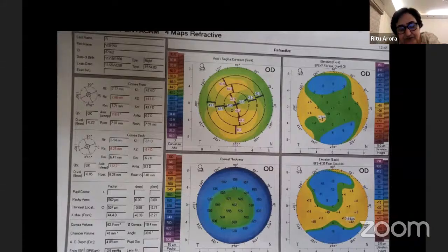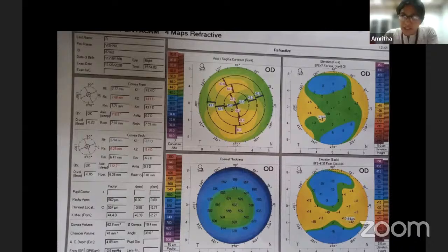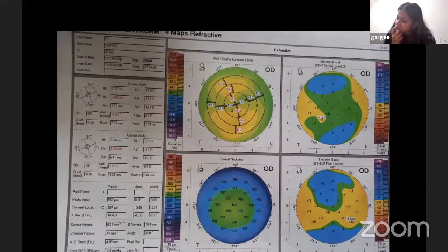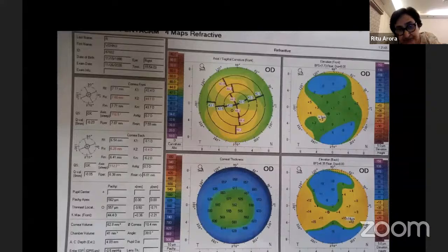And when do you see a hyperprolate cornea? In ectatic diseases? Yeah, maybe you are right. Yes, it increases, but more specifically, suppose it's not ectatic. You see it post hypermetropic LASIK, post hypermetropic ablation. In post hypermetropic ablation also the central area becomes steep, so there also this will become more on the -1 side. Okay, please carry on. Now tell me.